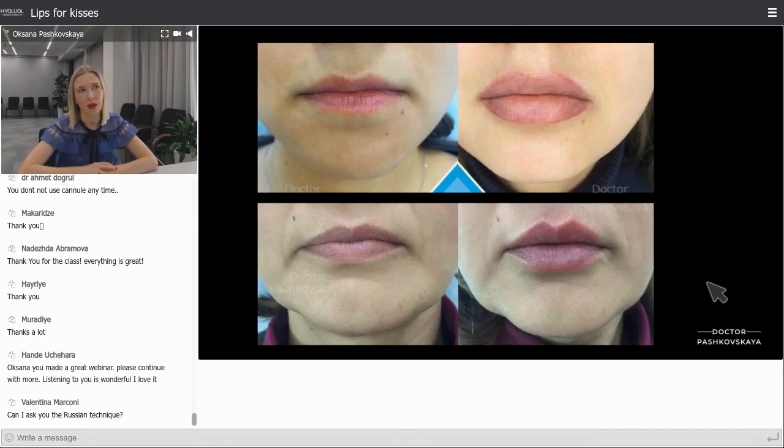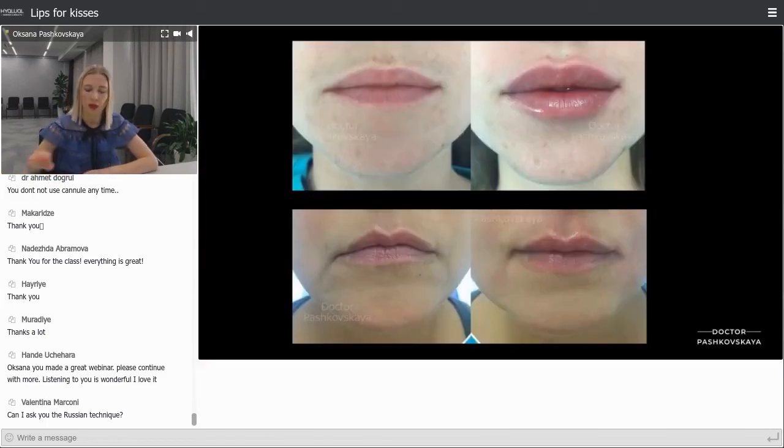the appearance as she wishes. So I recommend, of course, to use soft fillers such as Alexa Medium, and really achieve natural results. And also, colleagues, please.